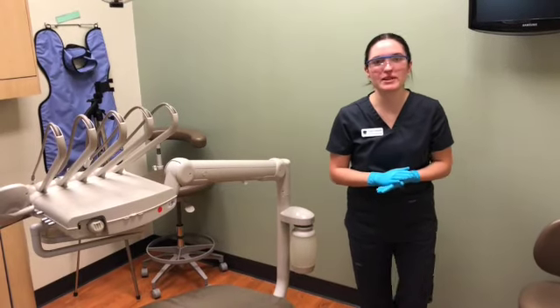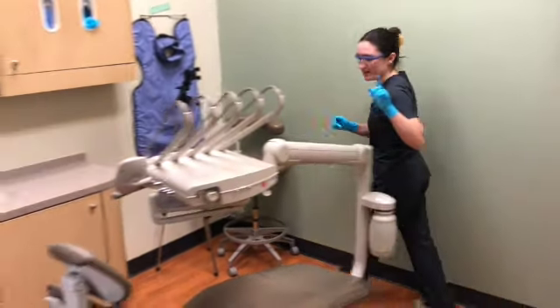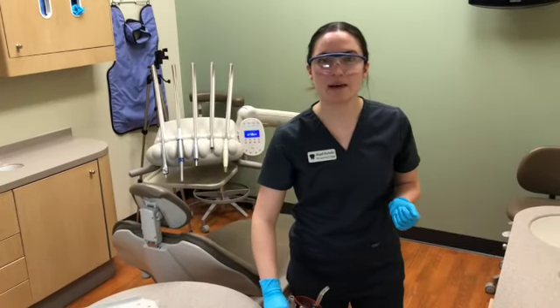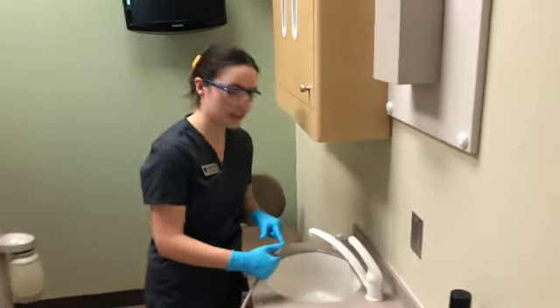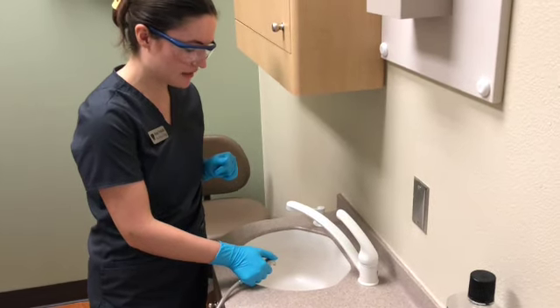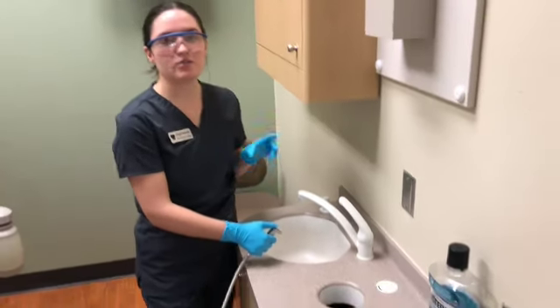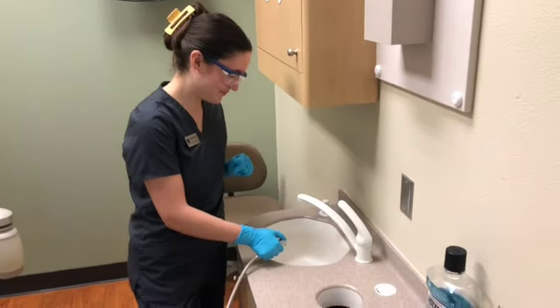And the next step would be to make sure that the water reservoirs are full. And fill this one as well as the second one over here. And the next step would be to check the air water syringe. First, you check the airflow for 20 to 30 seconds. And then you check the water flow for 20 to 30 seconds. And then you would check both together for 20 to 30 seconds.